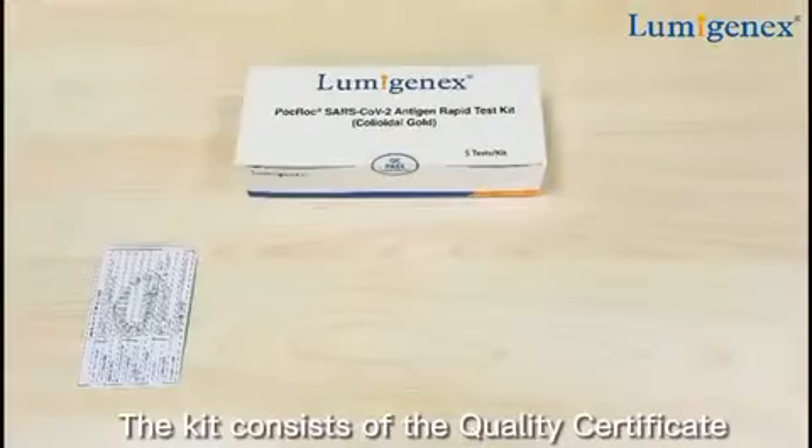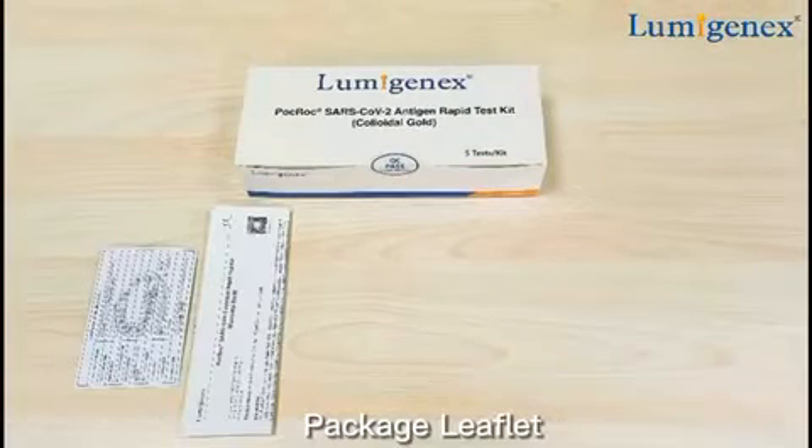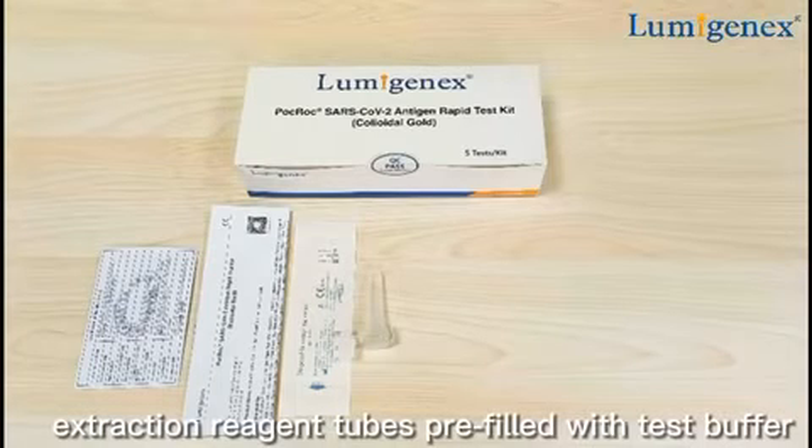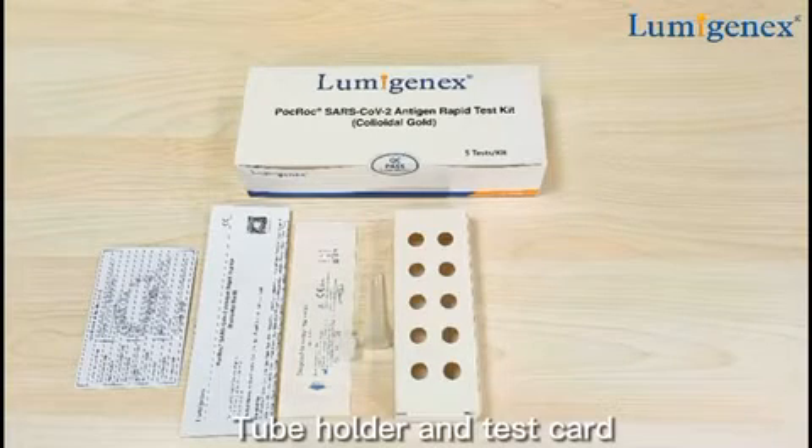Open the package. The kit consists of the quality certificate, package leaflet, sterilized swabs, extraction reagent tubes pre-filled with test buffer, tube holder and test card.